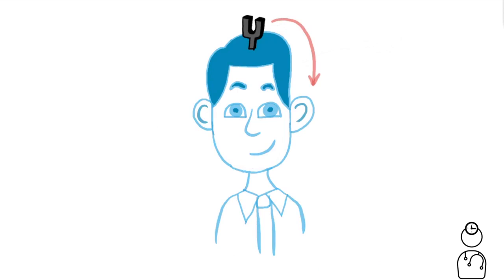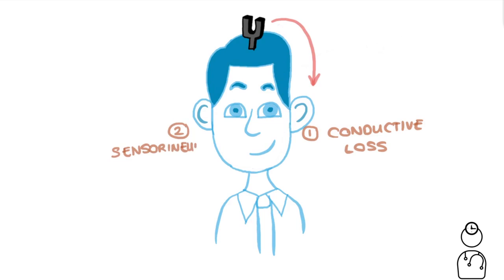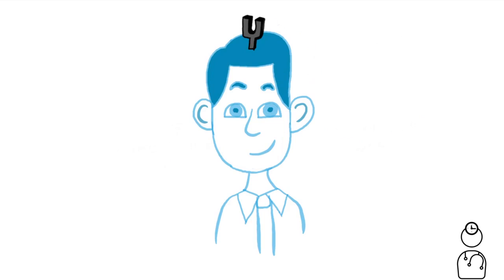We know when we did the Weber's test, Bob said it was lateralizing to this ear. That means either that ear has a conductive hearing loss, or the other ear has a sensory neural hearing loss. Now we can do the Rinne's test. So, we need to take the tuning fork, place it on Bob's mastoid process, ask him when he can stop hearing it, and then place it next to his ear.